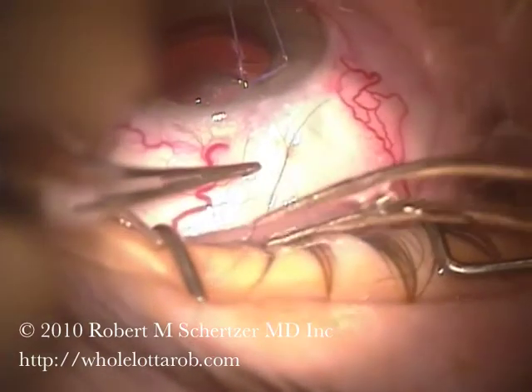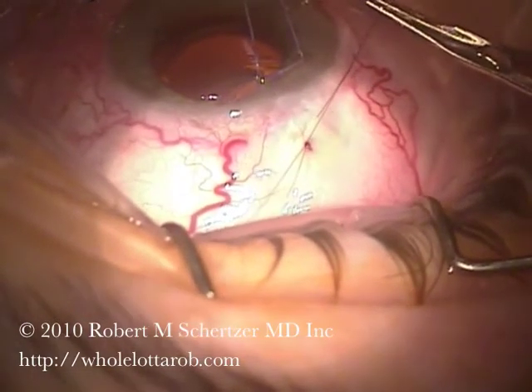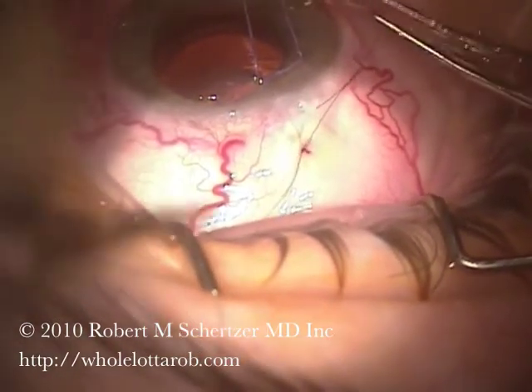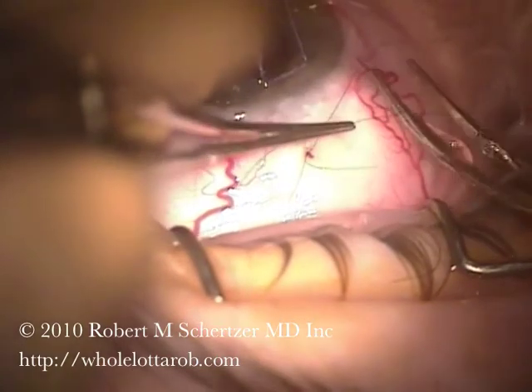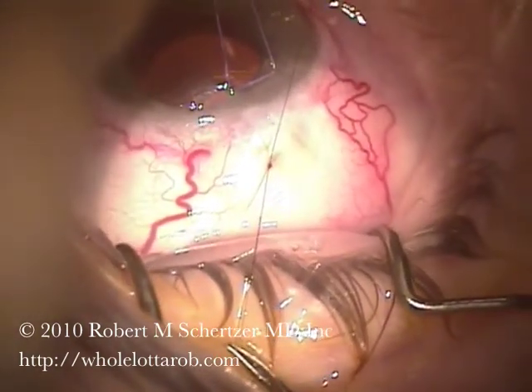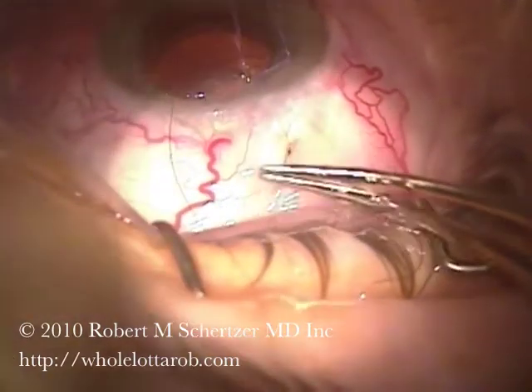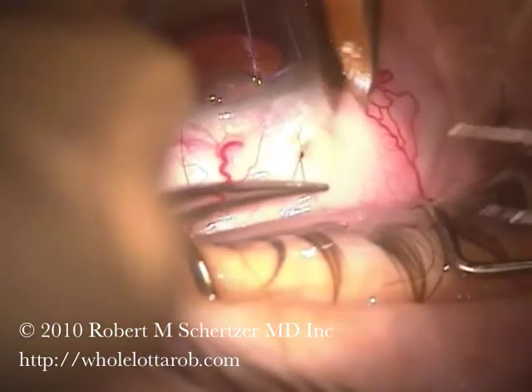And what's hard to believe, but true, is that this suture works its way through the conjunctiva, which heals on top of it. And when you see the patient in follow-up visits, within a few weeks, the suture is actually buried under the conjunctiva with a closed scleral flap.